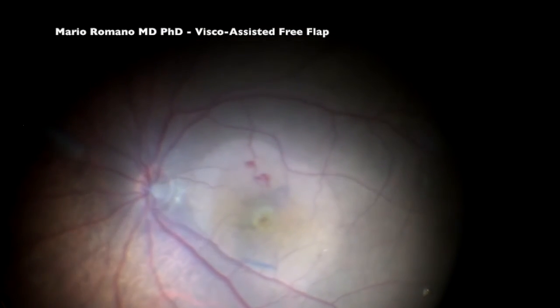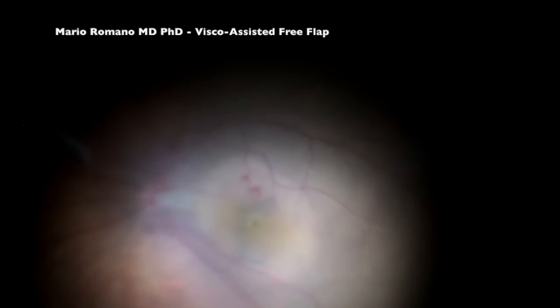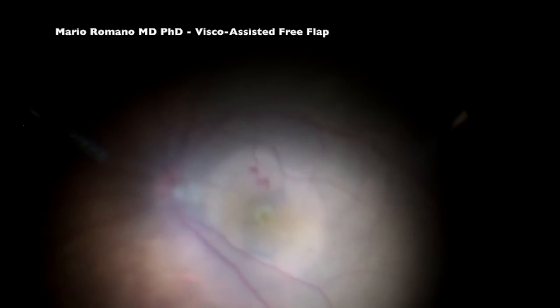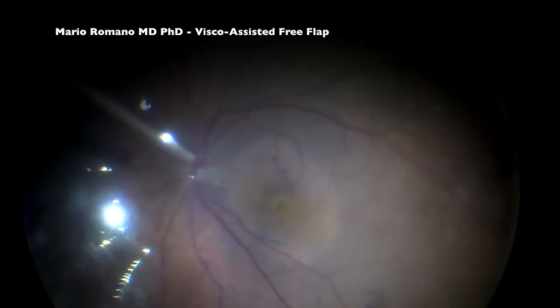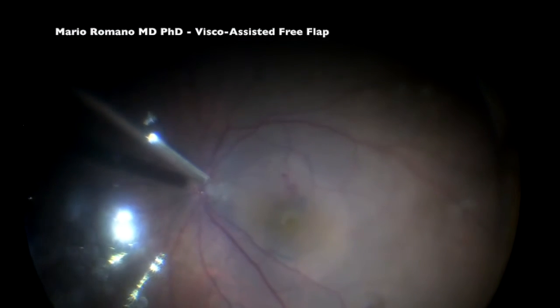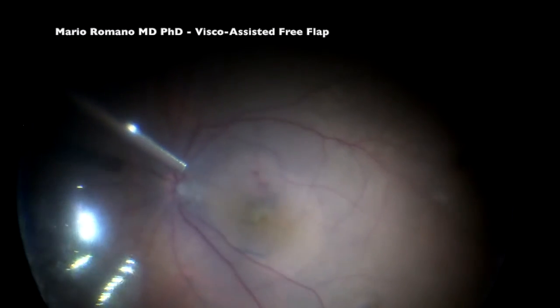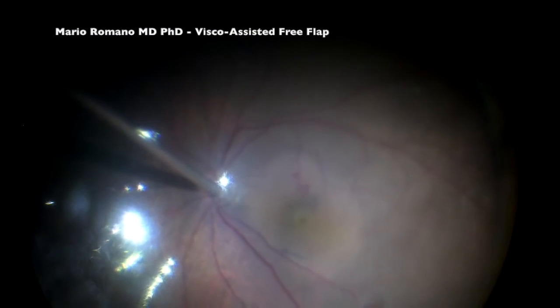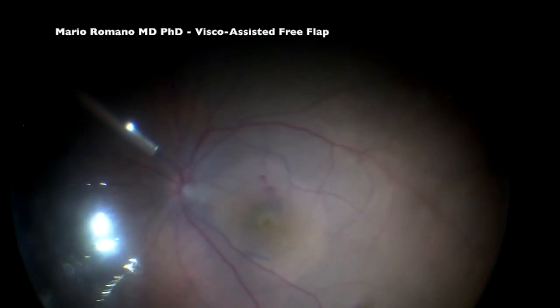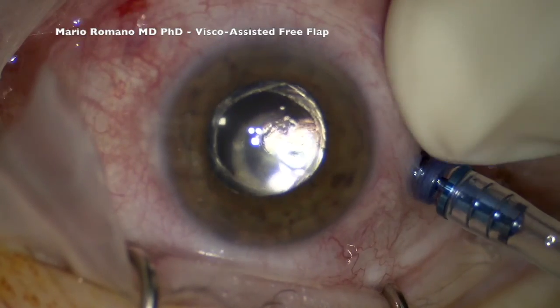As you can see now, we are switching on air. The air is coming. You can clearly see that the free flap is still there. Then we will increase the infusion pressure of air a little bit more, and now you can see it is dry from the water — there is just air and the flap is still there. At this point we are injecting SF6 gas at 20%. The interfacial tension of air is 70 mN/m, which will keep the free flap in the right position. The critical part was when we were under fluid and during the fluid-air exchange.